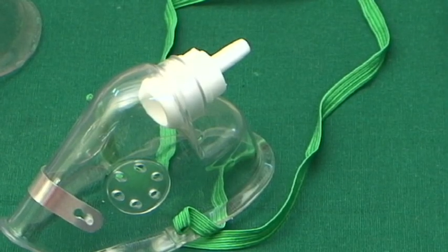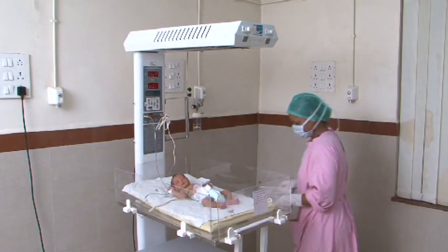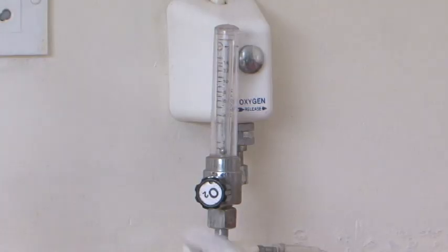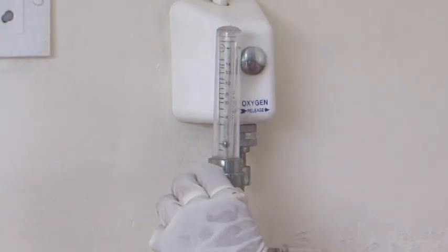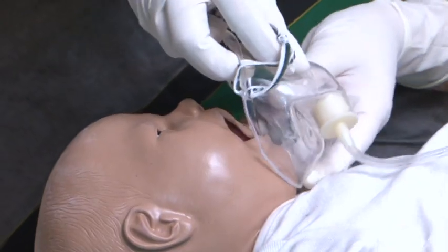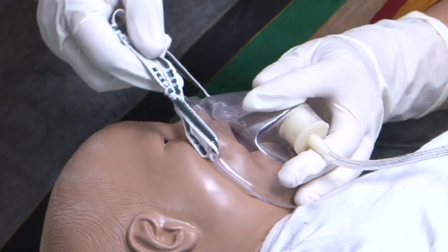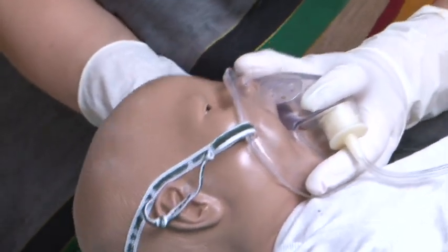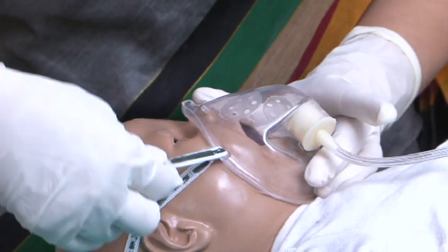Face mask. Select the right-sized face mask. Adjust the flow rate to the desired concentration. Place the mask over the baby's mouth and nose. Secure the mask in place using elastic or by adhesive tape.